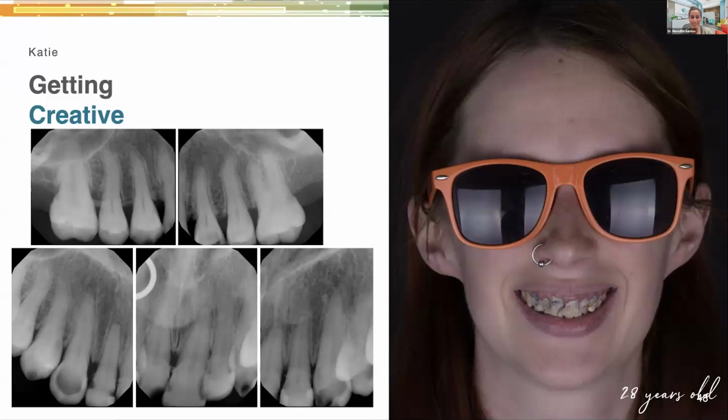So I don't have good photos of this one, but I want to include it because to me, this photo is just such a great reminder of having something in between a direct composite or a fancy Emax crown, why having something more transitional can be so helpful, or even just the fancy Emax crown, but at an economical level, right? Or zirconia puck. I mean, it really enables us to help people in such a profound way.